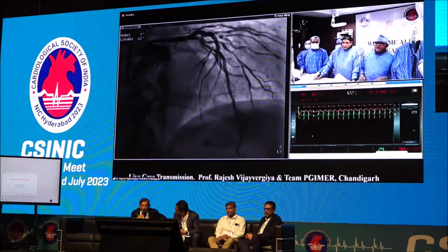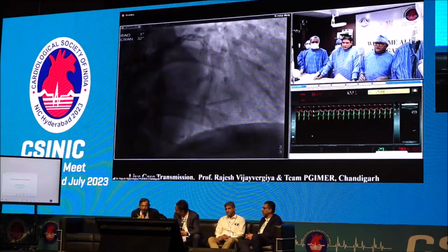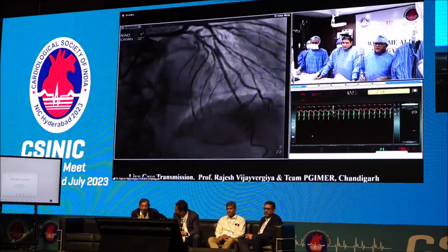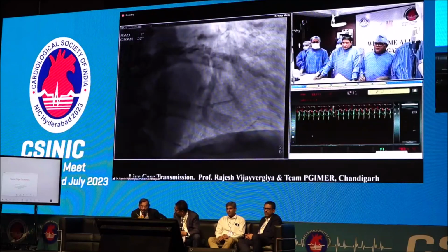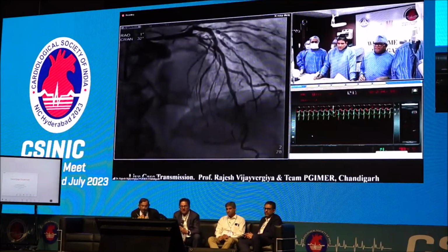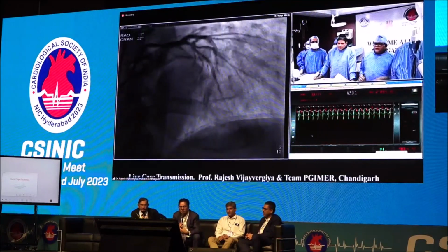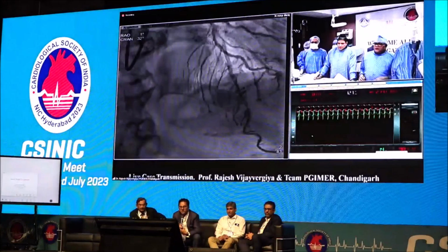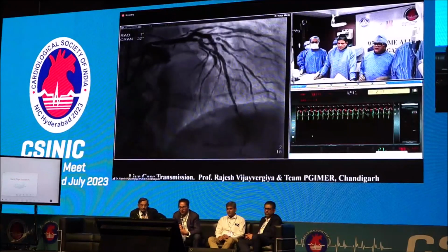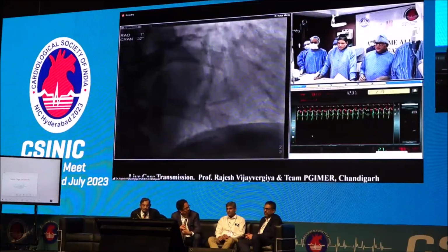Okay, Rajesh, you are angiographically definitely saying there is an ostial lesion of the LAD and LCX. I believe you are a man of the IVUS, so definitely I may extend possibly to the distal LM as expected. Okay. The question is how we're going to proceed. Are you going to proceed with a two-stent strategy, which I assume you will? What is your plan? What is the panel?